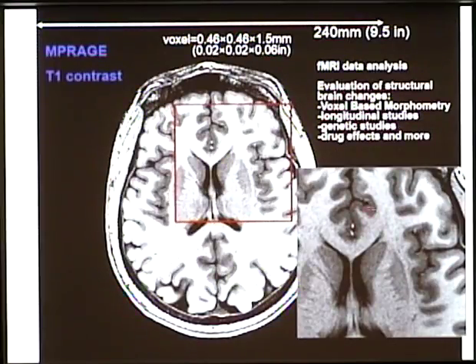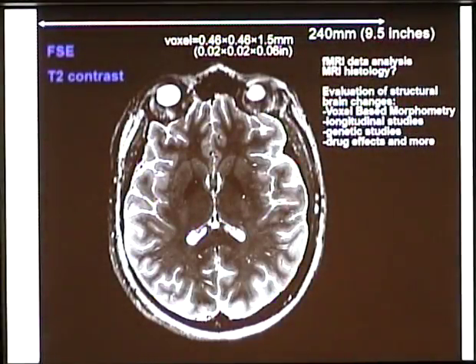So clearly this is the gray matter, this is the white matter, and this dark part is CSF. I'm not going to show you and talk about the detailed structure and small parts of the brain, how they're named, but this is a potential application of the structural image. But the remarkable thing about MR is that by flipping and changing a few things on the computer, I can generate completely different looking contrast.